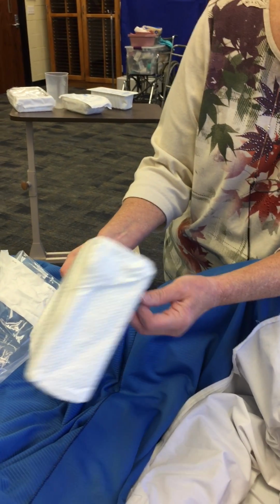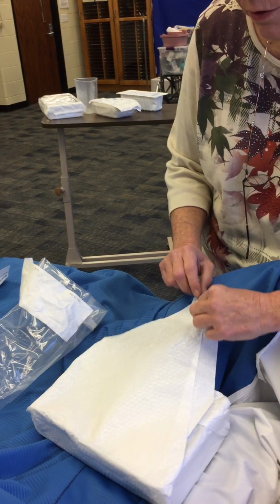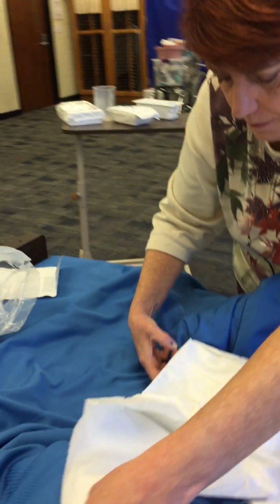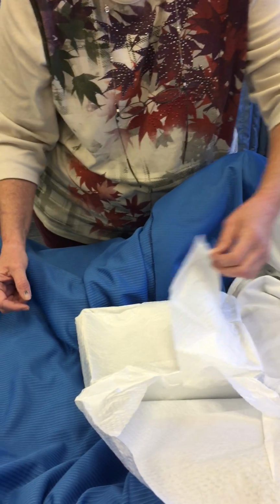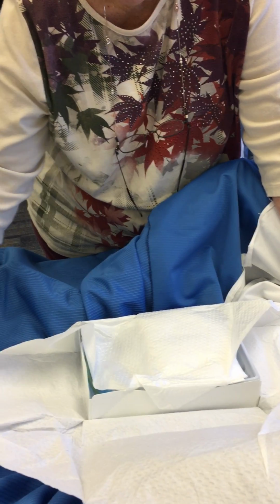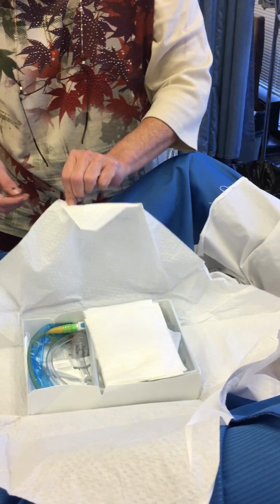What we're working on doing right now is setting up a sterile field. So you want to open this one first because all this is covered up. You open this flap. This flap. You remember the 1-inch rule. And then this flap.